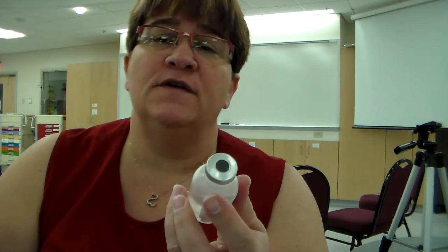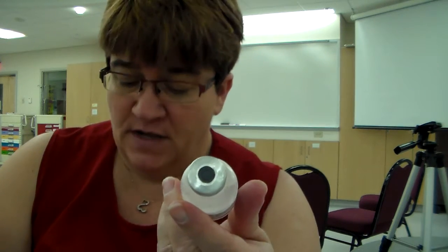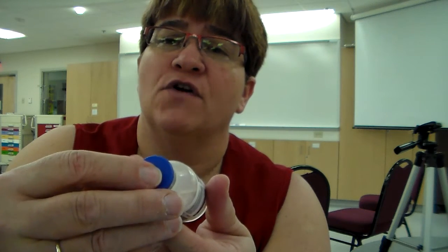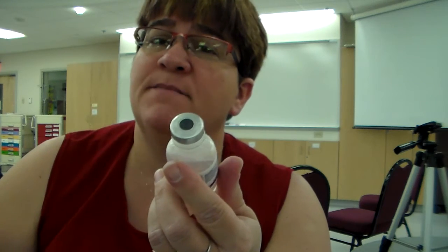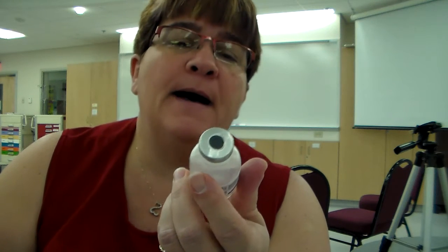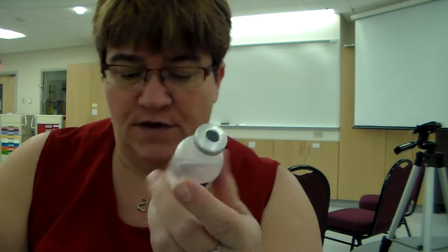So you're going to remove that, and some vials you're able to use as multi-dose. This one is a multi-dose vial, and that means that somebody's already popped this protective cover off before and has withdrawn some of the medication. So you want to reuse this, per your facility policy, since some vials will be multi-dose. So what do you do? Well, it's already been used. It's got microbes on the rubber part.